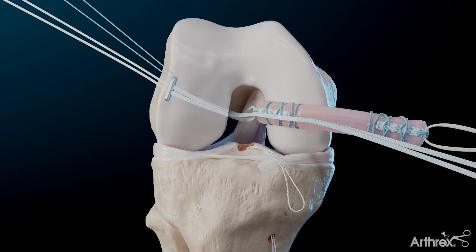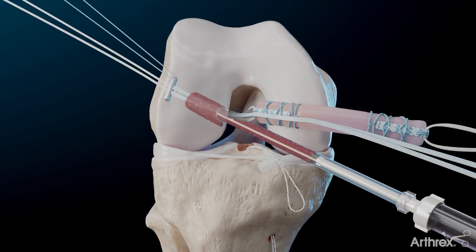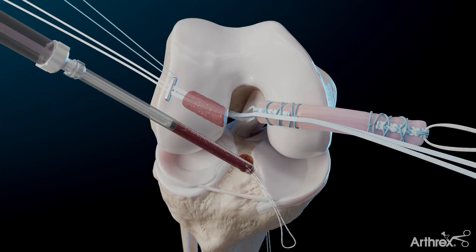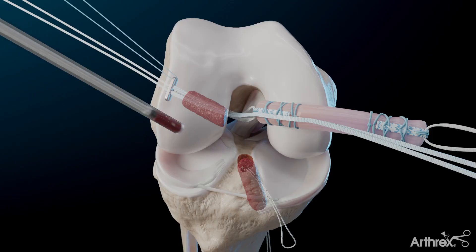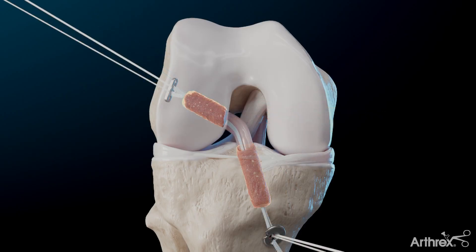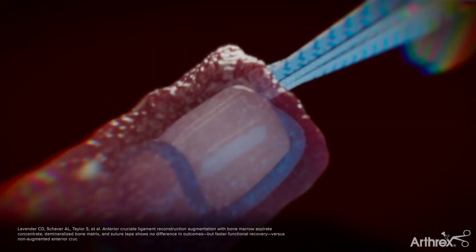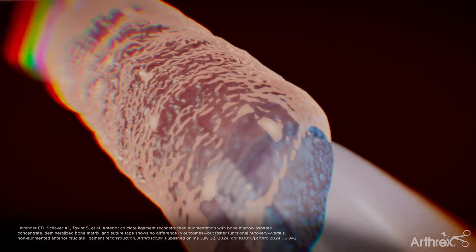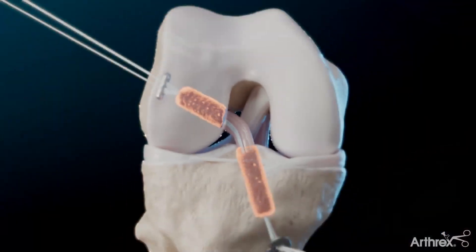From the medial portal, insert the delivery cannula preloaded with the bio-ACL composite and completely fill the femoral tunnel. Then move to the lateral portal and deliver the composite into the tibial tunnel. The bio-ACL composite graft compresses around the quad-link ACL graft, and fully filling both tunnels with this composite has demonstrated a reduction in tunnel widening post reconstruction.